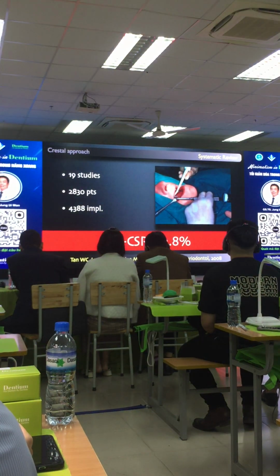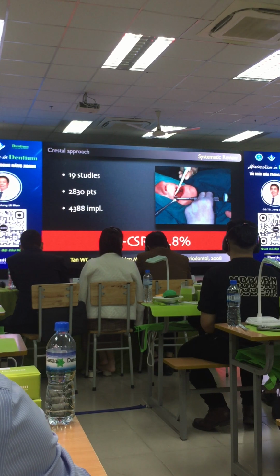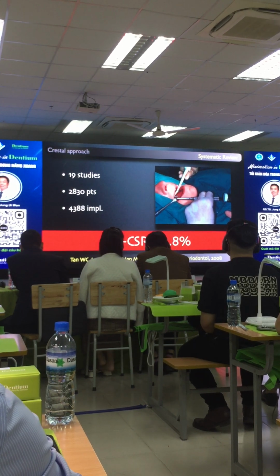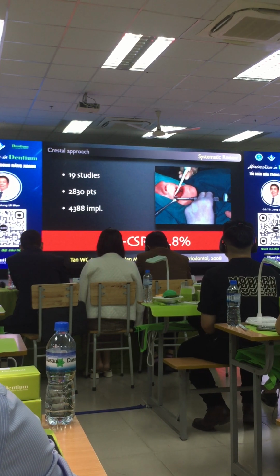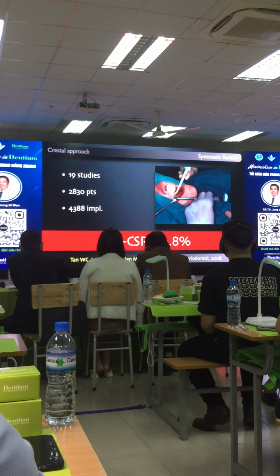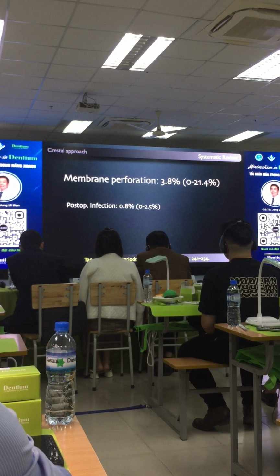For the less invasive technique, the crestal approach is preferred more and more. Systematic review demonstrated that the 3-year cumulative survival rate was around 93%, showing similar figures to the lateral approach. However, the crestal approach has also complications and disadvantages.